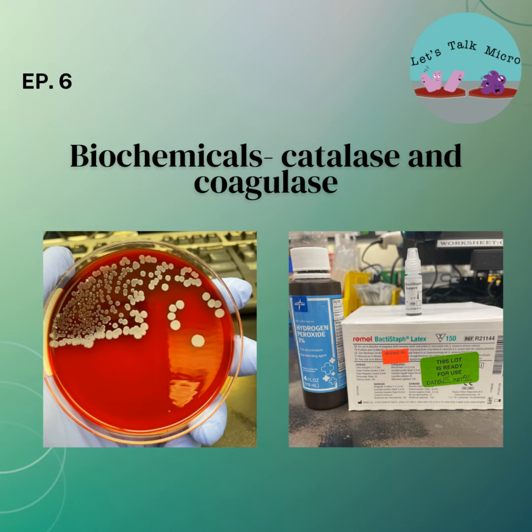Please be mindful that there are some organisms, like Staph saprophyticus and Staph schleiferi, that can give false reactions. So always correlate with your morphology. Staph aureus is beta hemolytic, but sometimes it can have a weak hemolysis. So if you get a positive reaction but the hemolysis is weak, go ahead and do an ID by another method, like the Vitek, MALDI-TOF, or MicroScan. Don't go with Staph aureus right away.